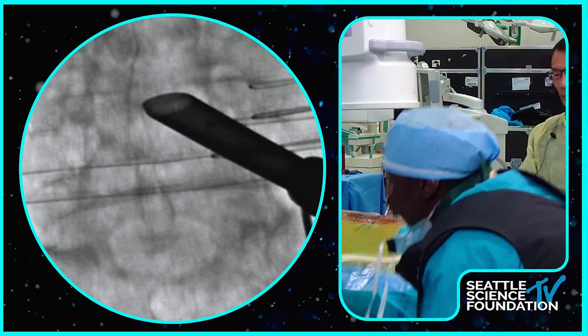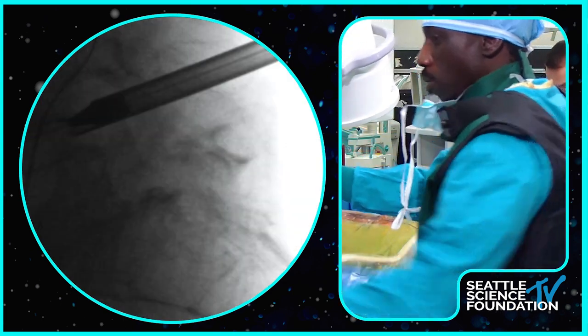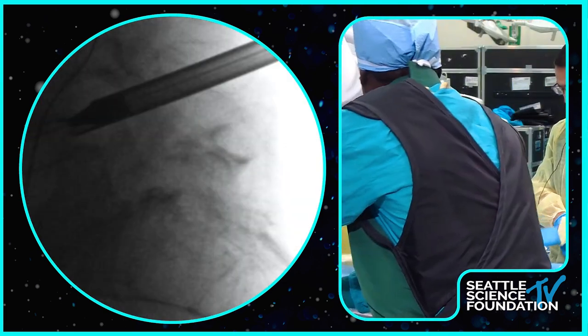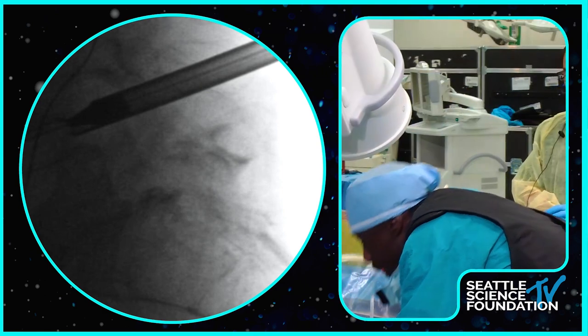Water flow. I got stuff all over the scope. No, he's just going to do. I have no water flow. So you either got to get new.